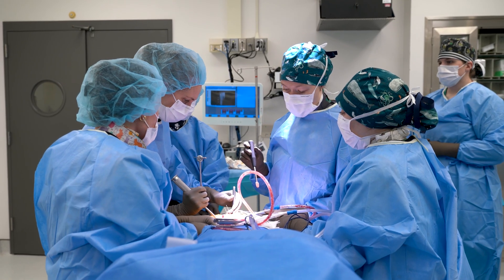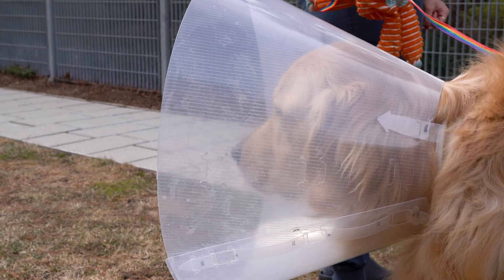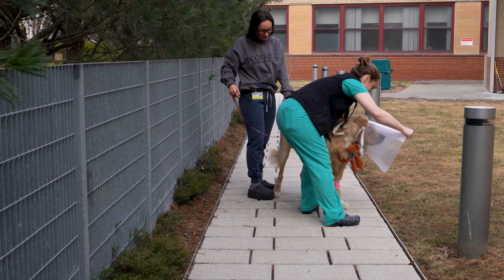We never do both hips at the same time. Most dogs are affected similarly on both hips. Mr. Darcy is now one week out from his second total hip replacement, and so far things are going very well.